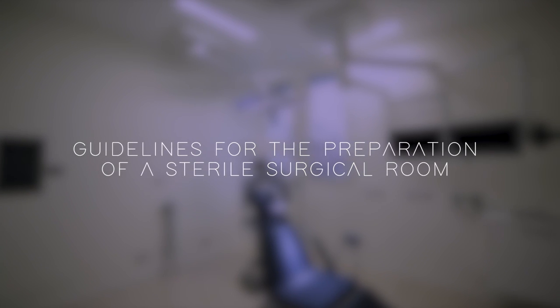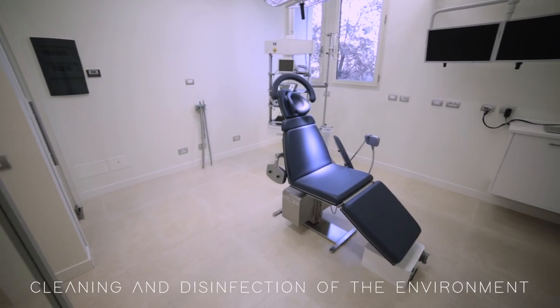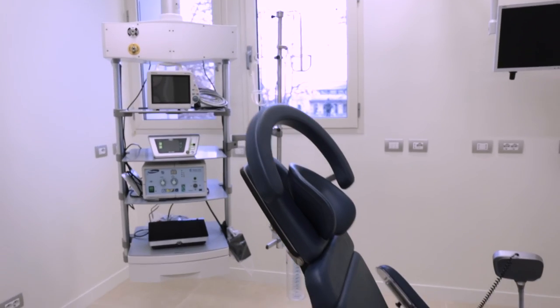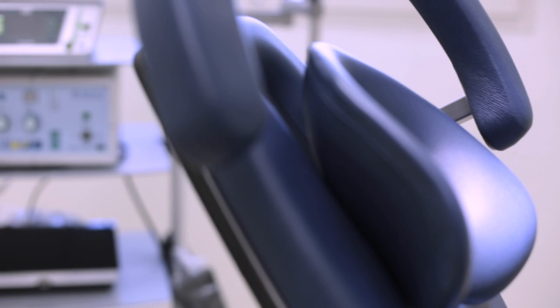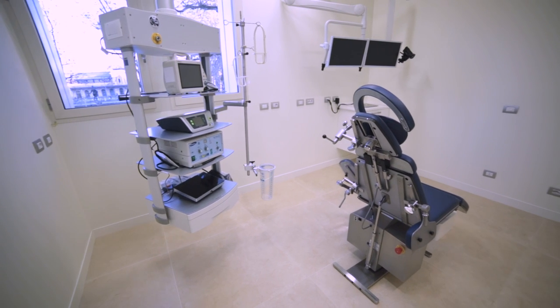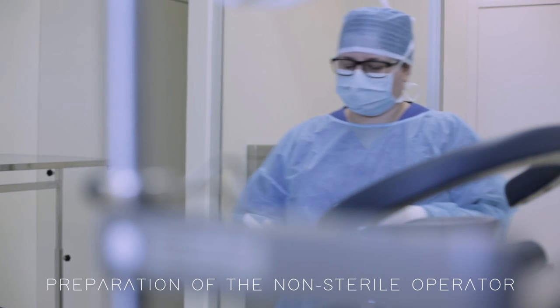Guidelines for the operating room sterile setup. The room must be free of all unnecessary furniture and equipment, and must have been previously adequately cleaned and decontaminated by assistants or designated personnel. The assistant must remove all jewellery and nail polish.